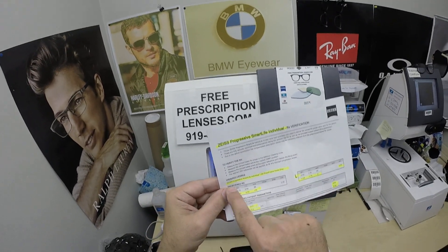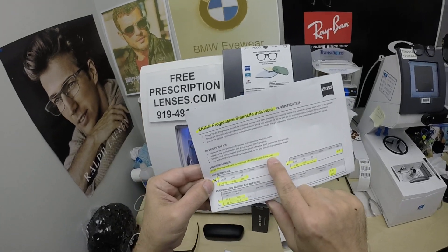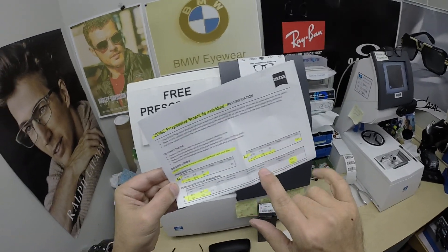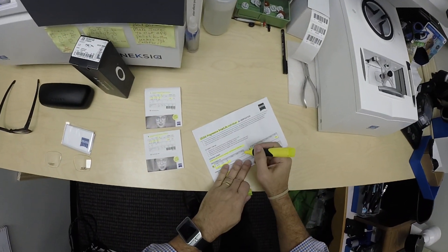I've got it highlighted here that it's in the polycarbonate photo fusion extra gray, the prescription for the right eye, prescription for the left eye, the add power. I forgot to highlight the add power for the right eye.